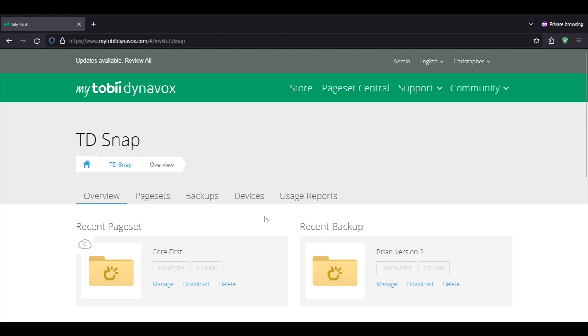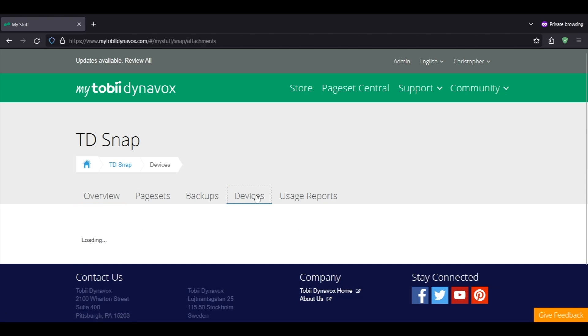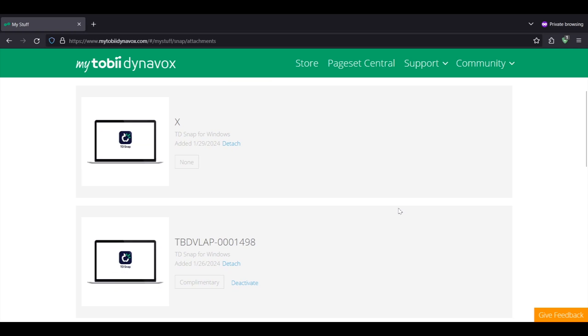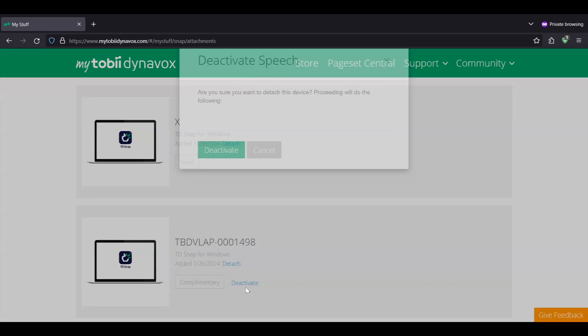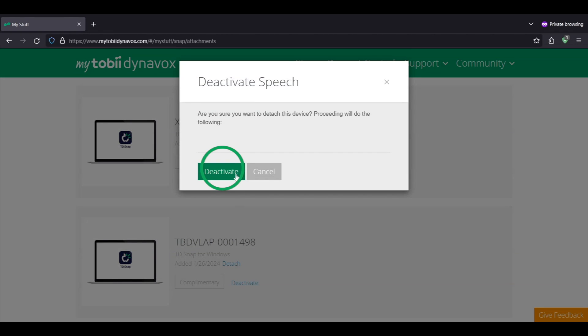Select the TD Snap tile. Select devices. Look for the device that has deactivate next to it. Click deactivate.